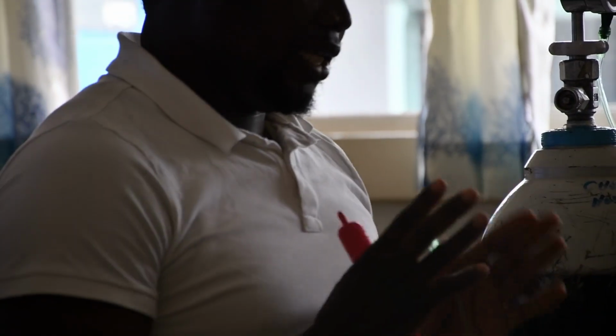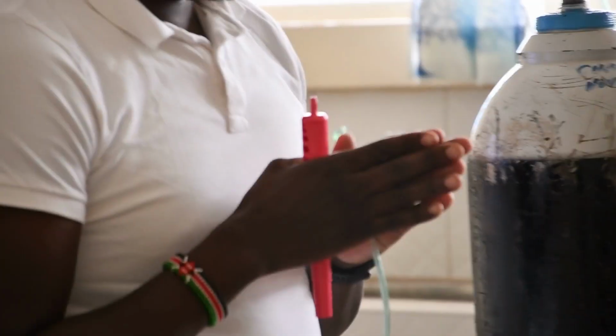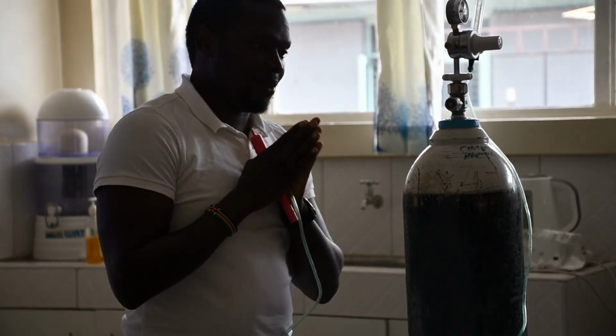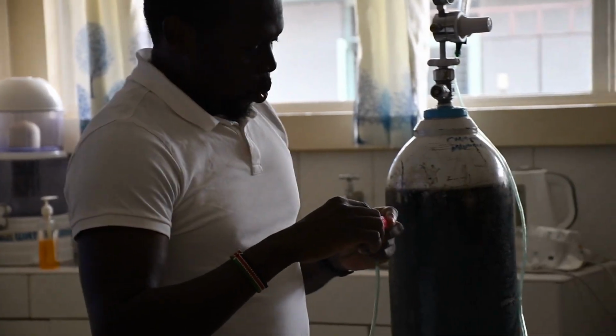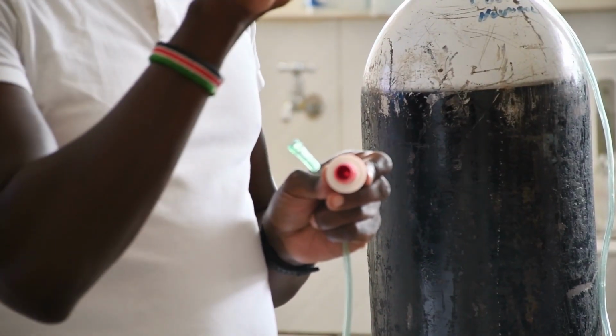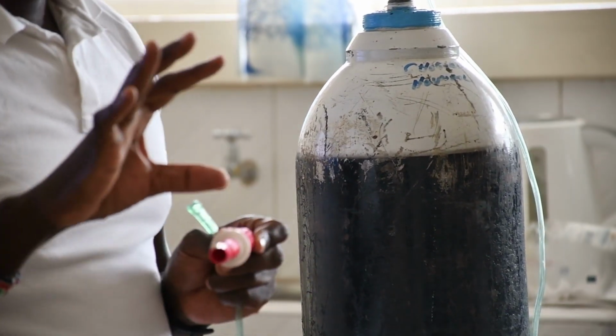The pressure increases, so the velocity becomes very high. This is something that is moving at a very high speed. So when it comes in here, it's a restricted area, and with that kind of restriction, it's trying to escape.